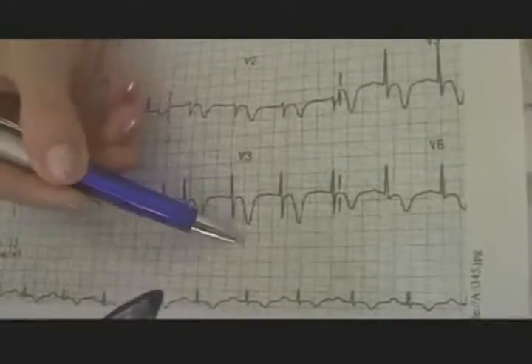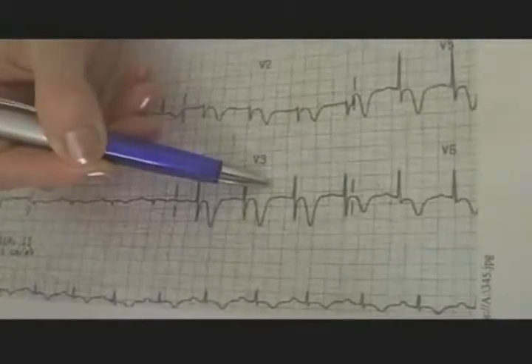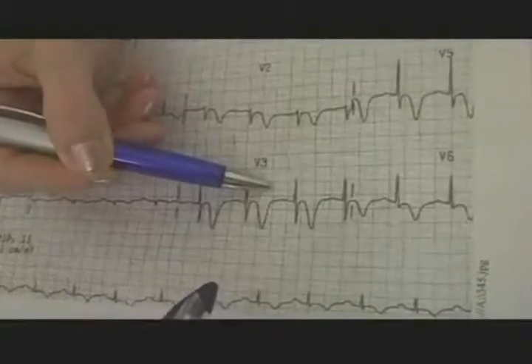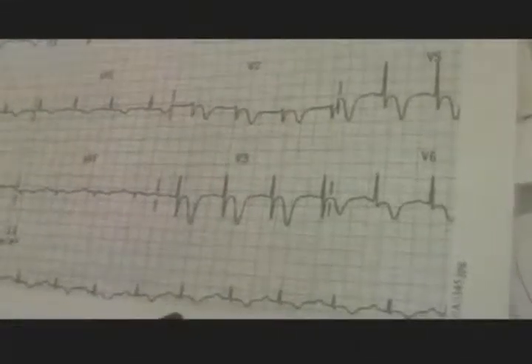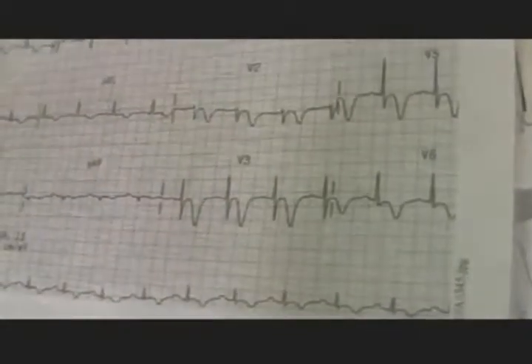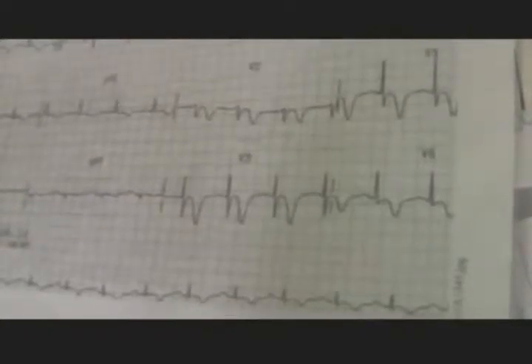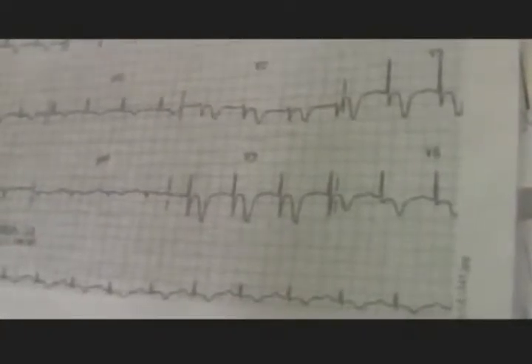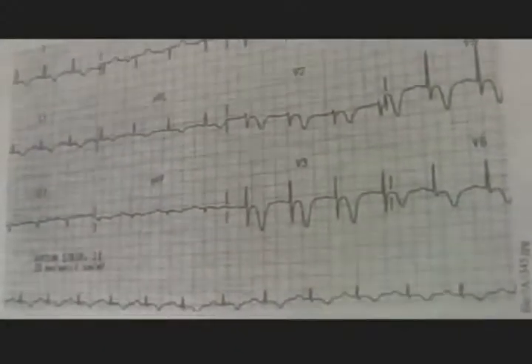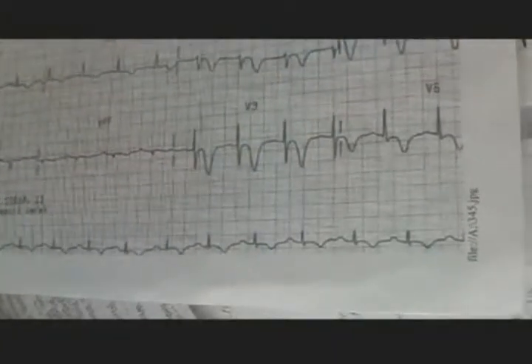We can say only about ischemia. Only about ischemia. T wave ischemia. Plus ST, damage. Plus Q, necrosis. Only Q without ST and T, post-infarction cardiosclerosis. On this ECG, we reveal only ischemia and we'll see where it's localized.